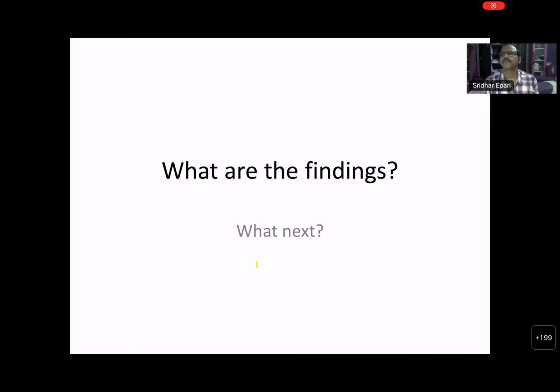With a ill-defined left frontal lobe lesion, on microscopy we find a tumor with microcystic spaces with a fibrillary background and hypercellularity with cellular pleomorphism. There is no microvascular proliferation. So what should be your findings now? Histological impression: astrocytoma, a diffuse glioma. Yeah, so at this point of time, it's a diffuse glioma of astrocytic morphology, and not enough features to call it grade 3.